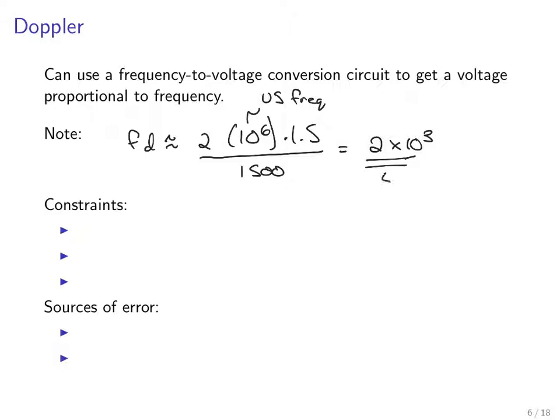This is interesting because this is in the audible frequency range. So it's easy to make a device that transduces flow to a change in pitch of a sound.